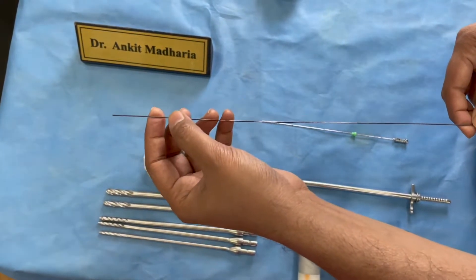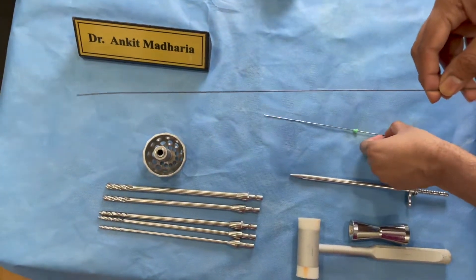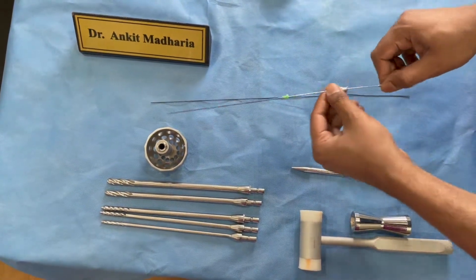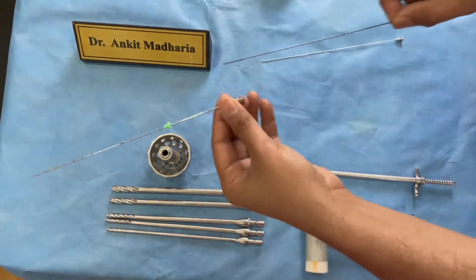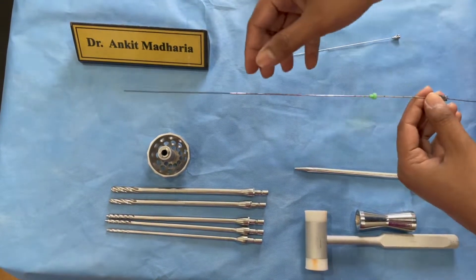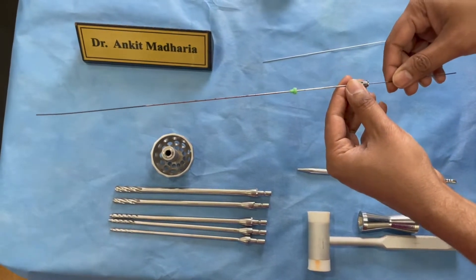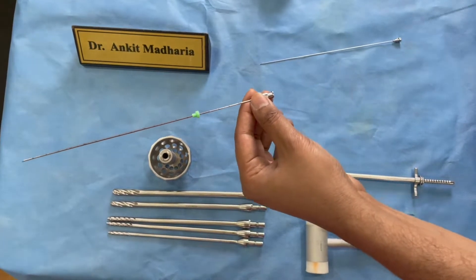A regular metallic guide wire usually bends in 3 or 4 surgeries. It is very essential that your guide wire should slide very easily through your needle. If you have a guide wire that is getting stuck, you should change it — it should be easily passable through the needle.